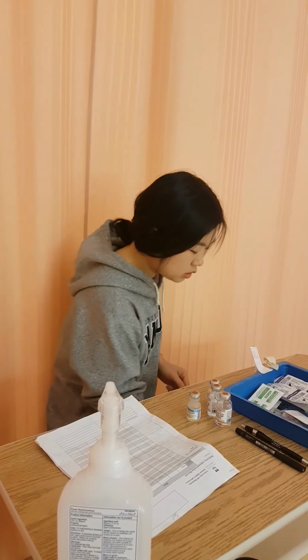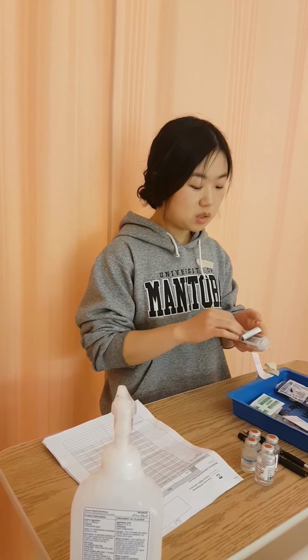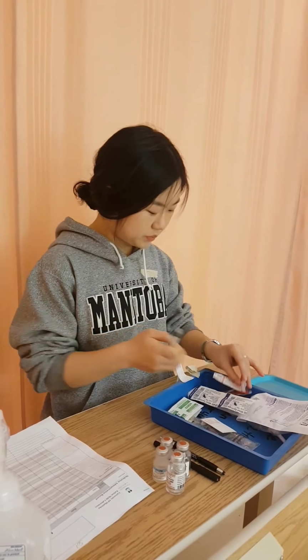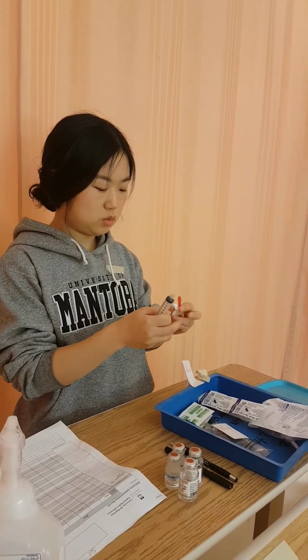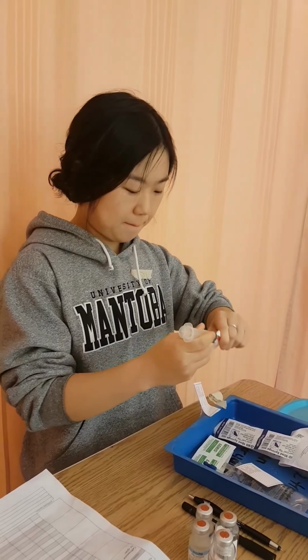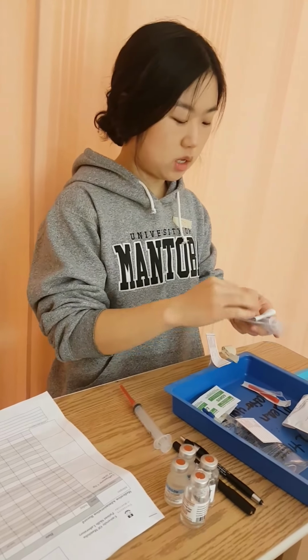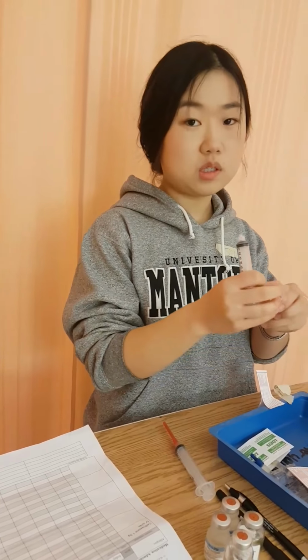Okay, so while it's drying, I'm going to prepare my syringe. I have a 10 milliliter syringe and a blunt fill needle. I'm going to open it carefully so as not to break sterility while I'm connecting it. And I'm going to do the same for this second set of 10 milliliter syringe, and I'm going to use this later.